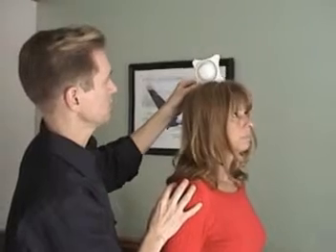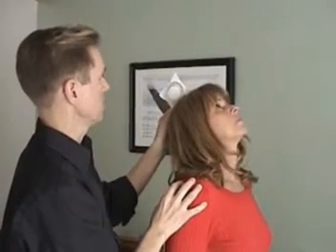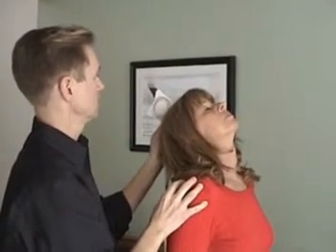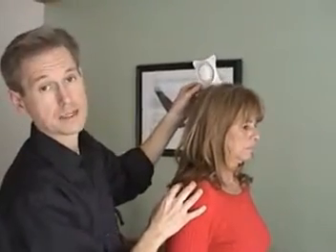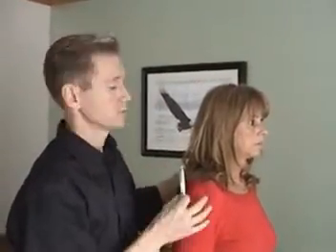Now we'll do extension. Marsha will go back and I'll just follow her backwards. She's now at 60 degrees of cervical extension. The optimal for extension is 75 degrees, and optimal in flexion is about 40 degrees in that ballpark.